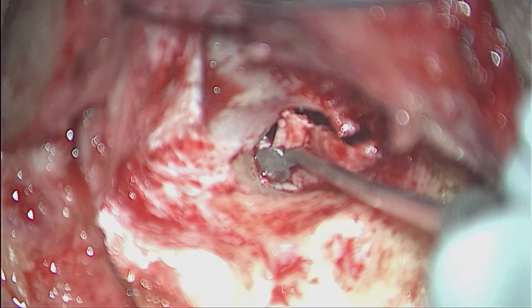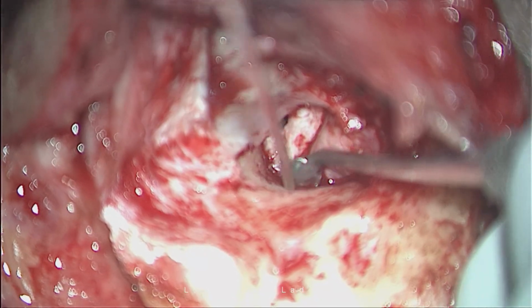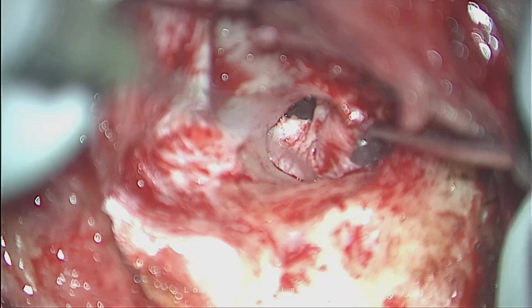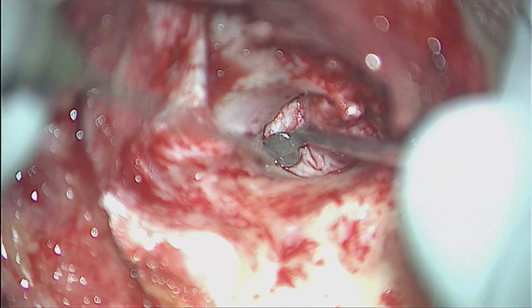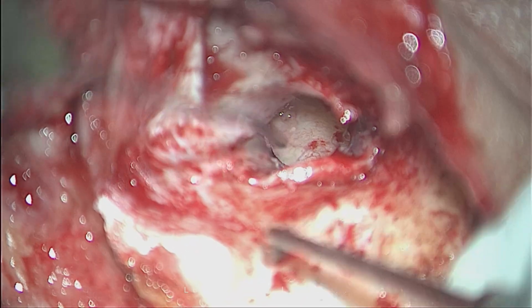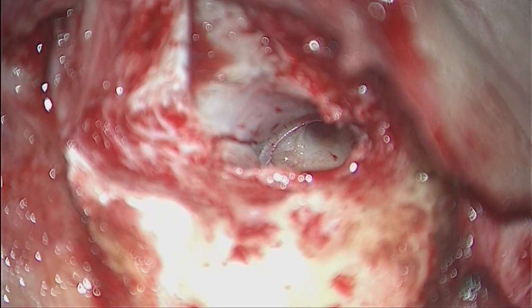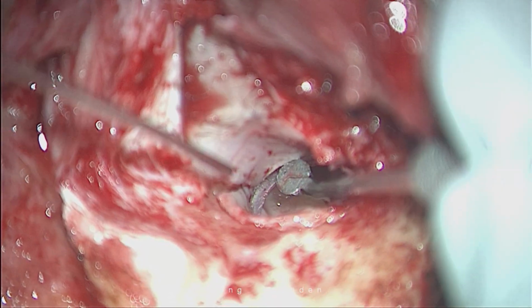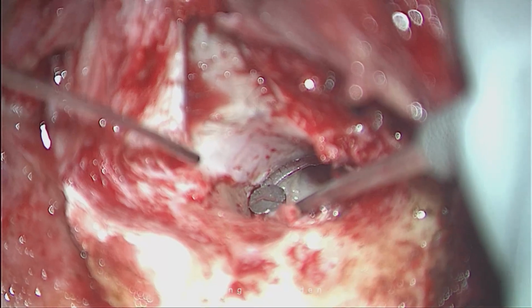See, simply you can raise the flap with the same principle, elevate it, bang on the bone, respect the flap, keep your suction behind your instrument so you don't damage it. This flap or epithelium is vital. This I have not extended till the tympanic membrane level. And I have limited this incision medially, a couple of millimeters lateral to the annulus, because we have to go circumferentially. Now I will make this incision circumferentially like this so that I can avoid elevating this unnecessarily. That would otherwise make the life of the surgeon cumbersome, which is not needed.